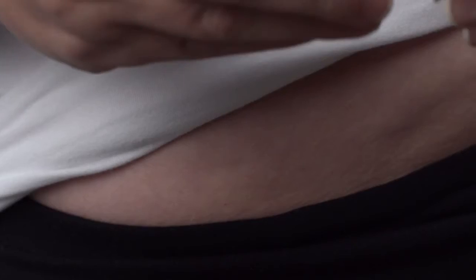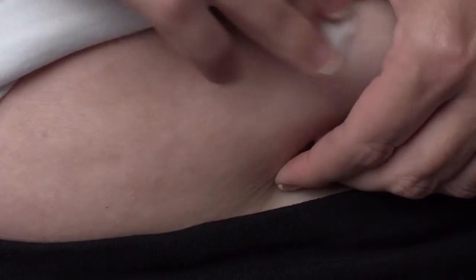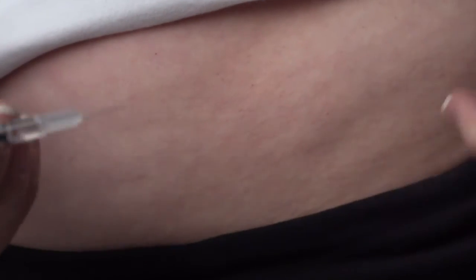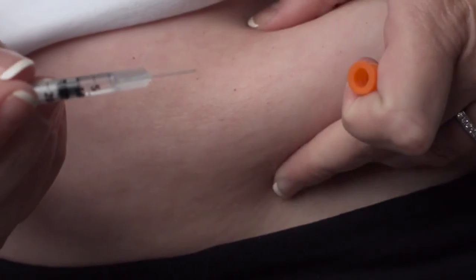Using an alcohol swab, clean the injection site and allow to air dry. You should alternate injection sites each day. Hold the syringe in your hand like a pen or pencil. With the other hand, gently grasp a small fold of skin between your thumb and index finger at the selected injection site.